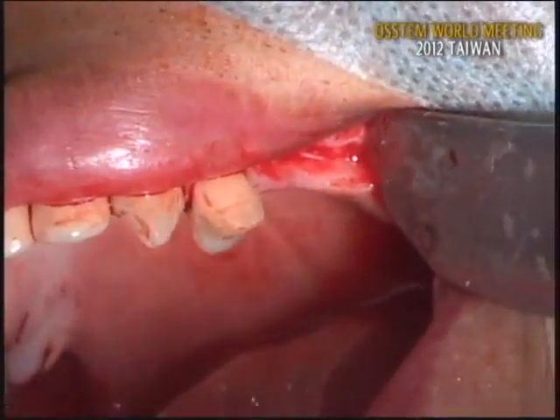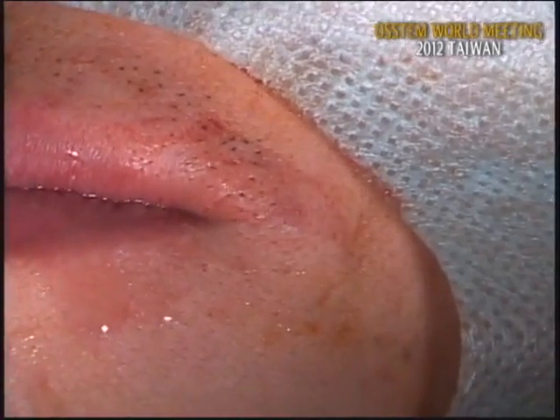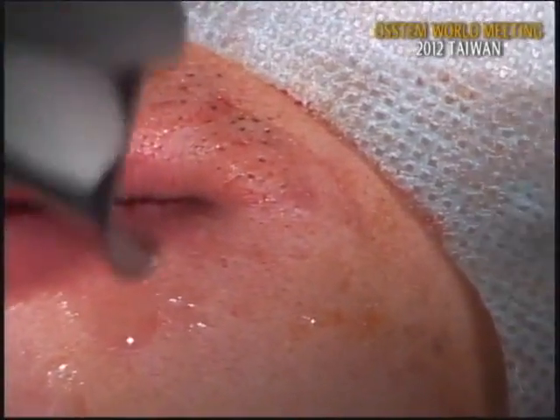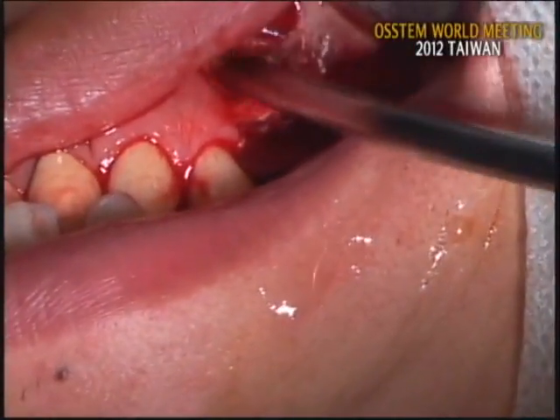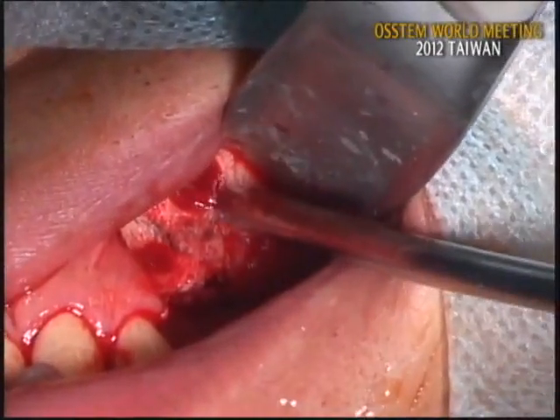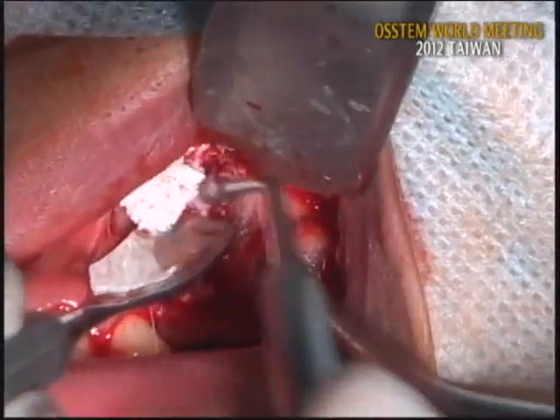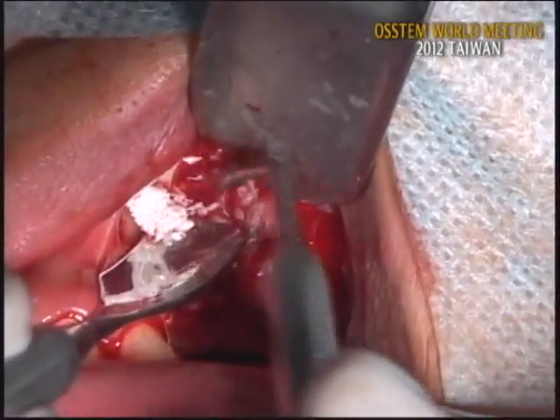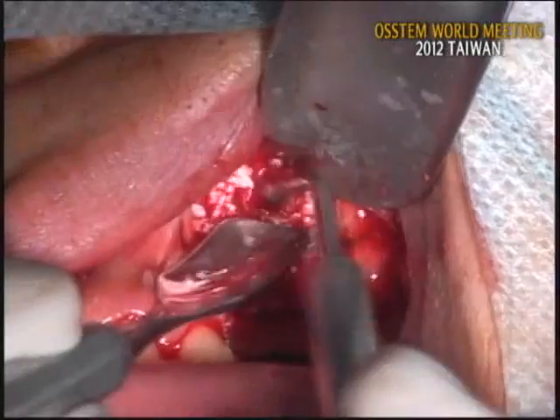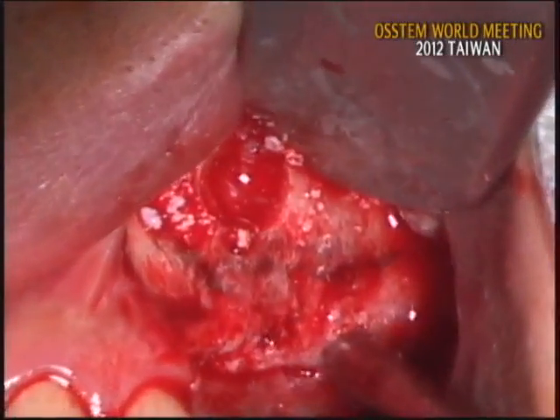Okay. Let's graft the material. Here I prepared the BIOS also. And let's graft. Not this one. Okay, this one is better. The syringe type grafting material is better, but here I just use this, and I will push the graft material inside the sinus. This one, here and here.